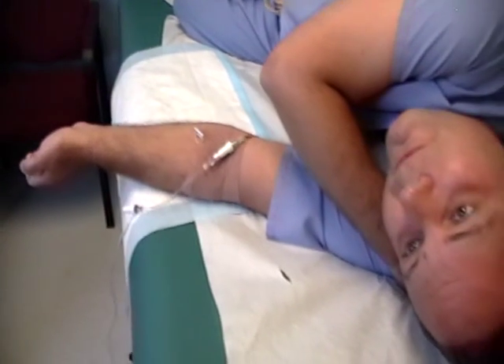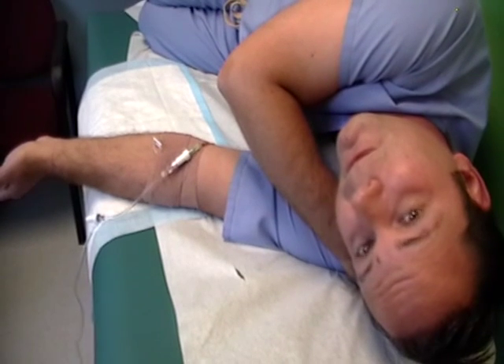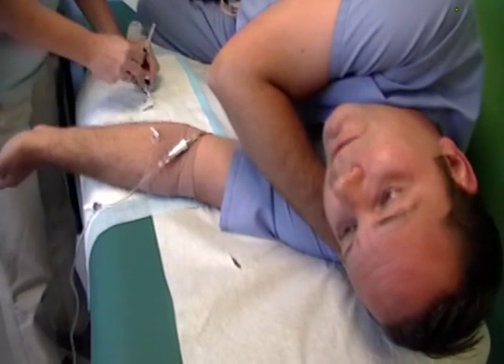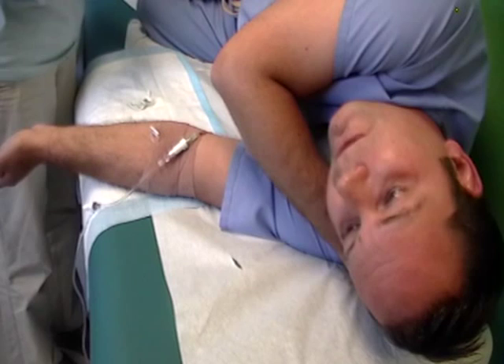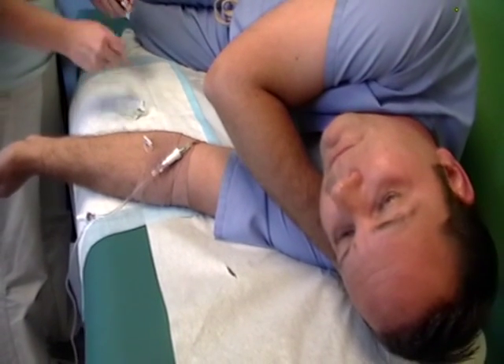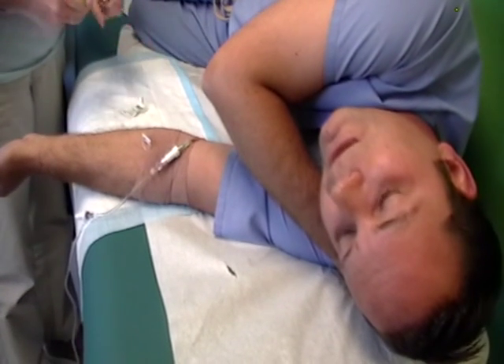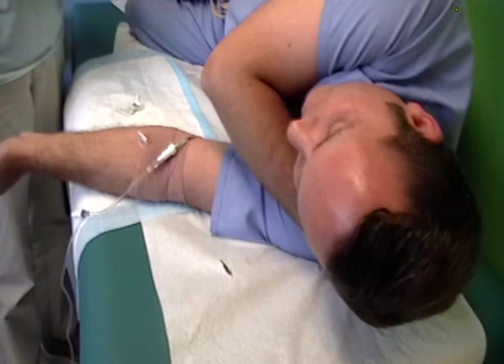Hi, Dr. Windish again from Sparks Pediatric and Adolescent Medicine. This is part of our ongoing educational series for professionals. Today we're talking about how to give an IV push. I am currently experiencing the joys of kidney stones, so Pat is about to give me some Toradol.